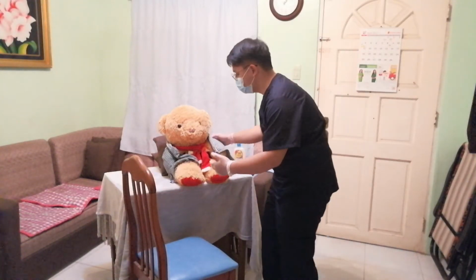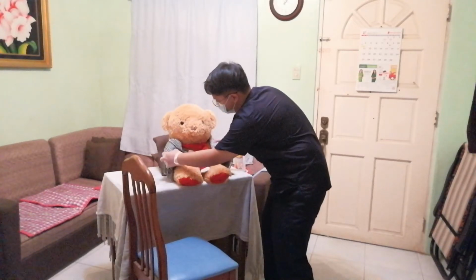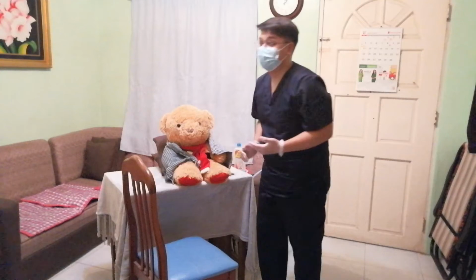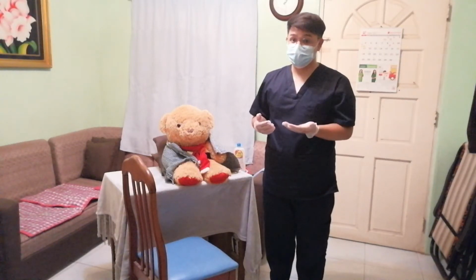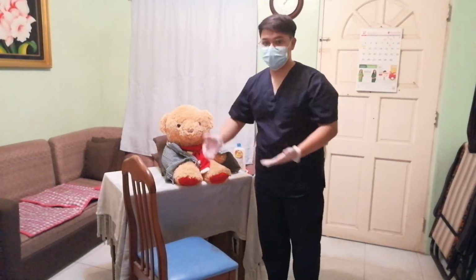So for our 15th step to our 17th step, first I will be stating the procedure before doing the actual transferring of the patient to our chair.